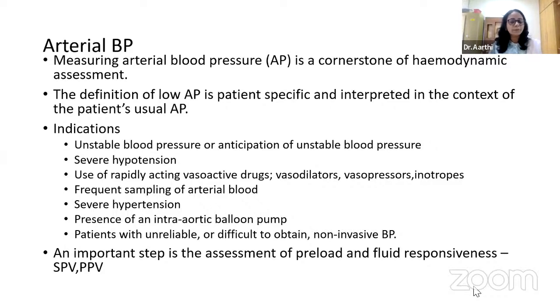There is another upcoming indication for arterial blood pressure monitoring, which is monitoring of systolic pressure variation or pulse pressure variation with respect to the arterial waveform analysis in patients who are mechanically ventilated. And this is an important step in the assessment of preload and fluid responsiveness, which I will be talking about shortly.